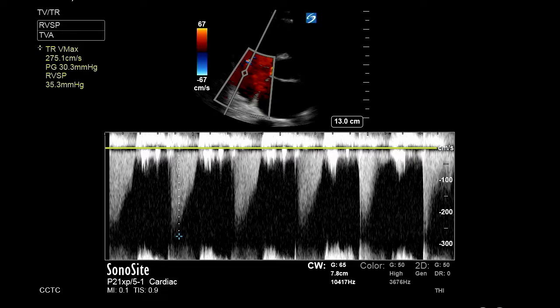From your calculations menu, you can select tricuspid valve max and place this pointer at the peak of your curve. Your machine will then calculate your value.